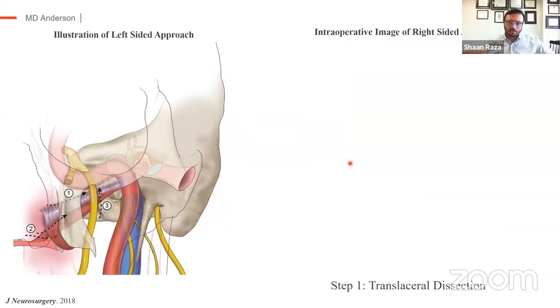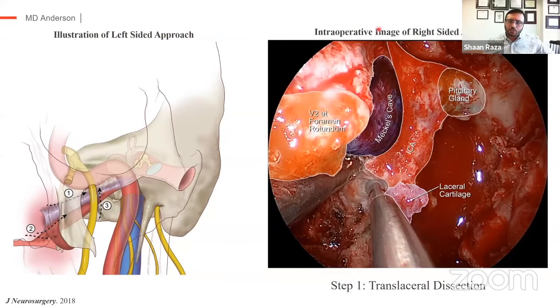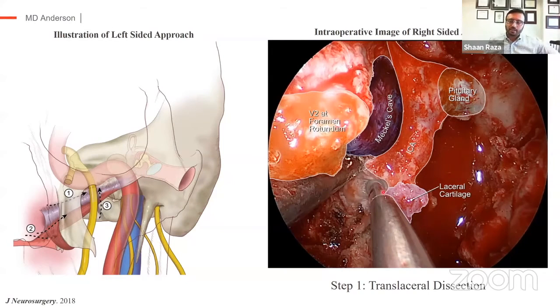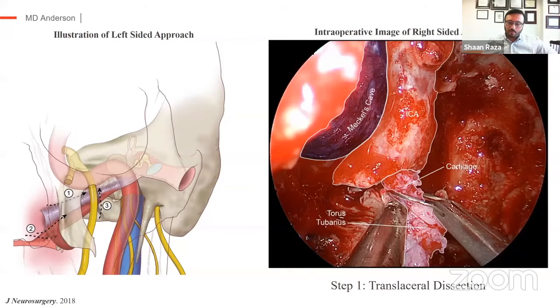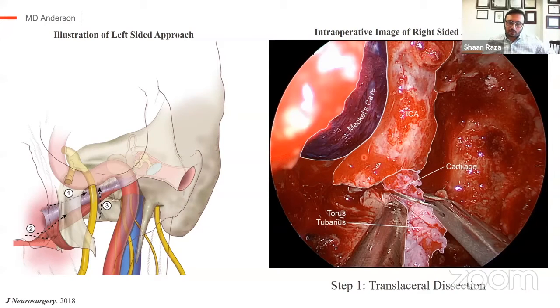Within the skull base, the next steps are focused on the carotid artery. V2 has been skeletonized going all the way back to Meckel's cave. The horizontal, periclival, and cavernous segments of the carotid artery are completely skeletonized. Given disease was present here, I did a mid and low clivectomy. I'm resecting bone around foramen lacerum such that you're only left with the fibrocartilaginous tissue along the inferior half of foramen lacerum, which is then sharply transected. This allows the ICA to be mobilized superiorly, and by transecting this fibrocartilaginous tissue, it really helps with the eustachian tube dissection.